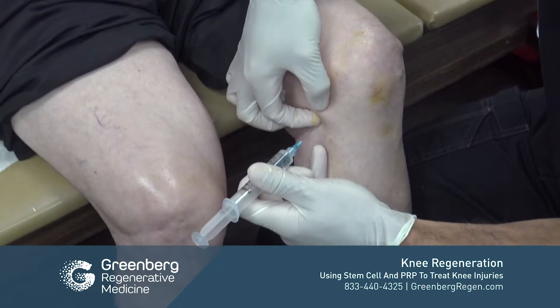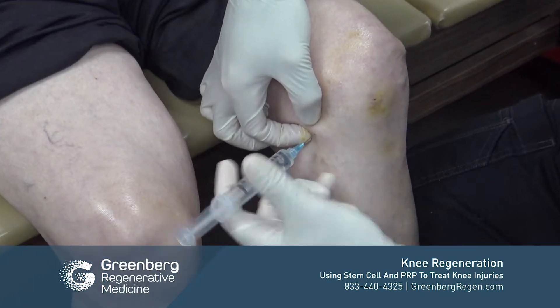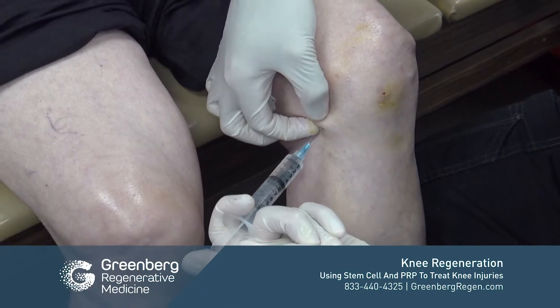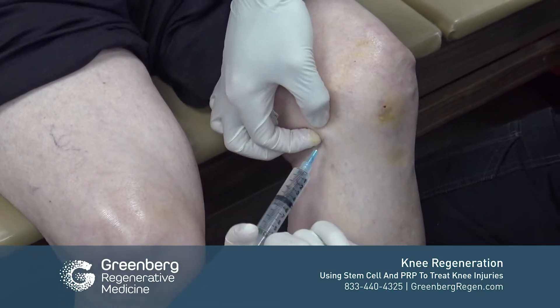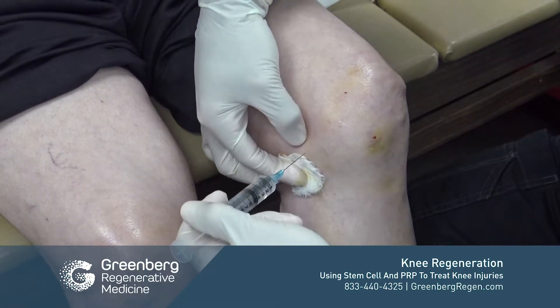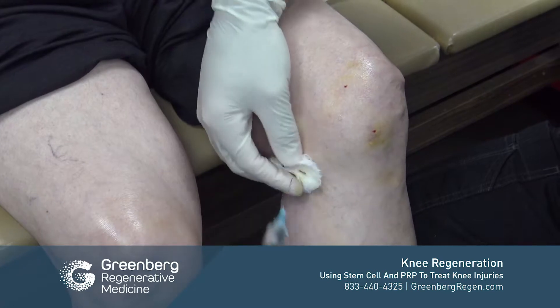This is done with some lidocaine and a little bit of bicarbonate. If you enter the skin very quickly, it doesn't really hurt the patient — technique is key. The anesthesia should just take a short period of time to set in.